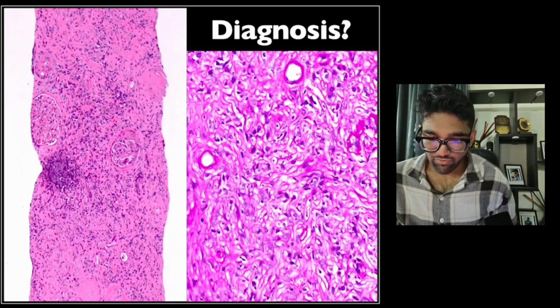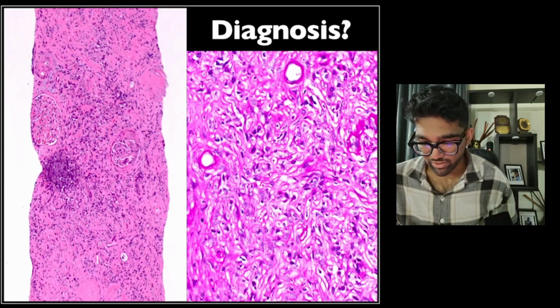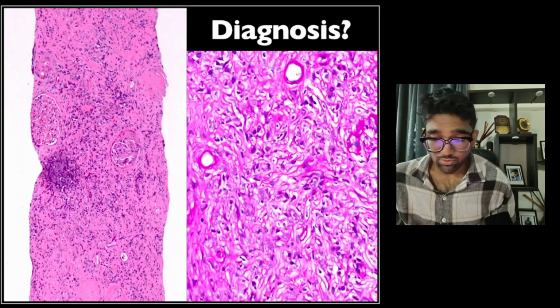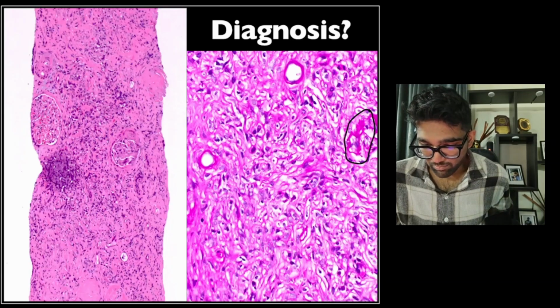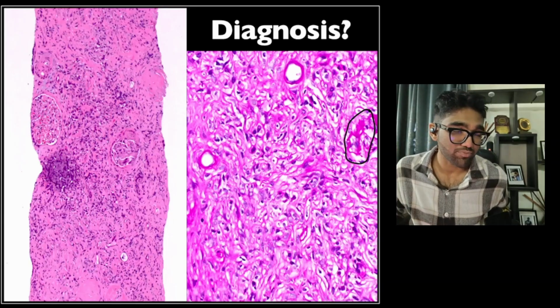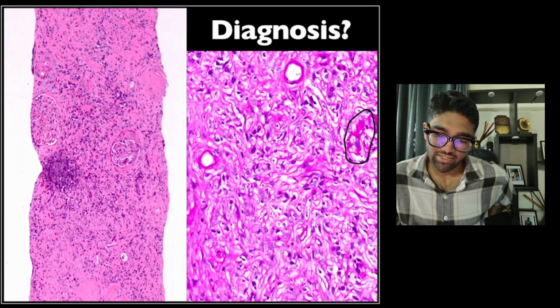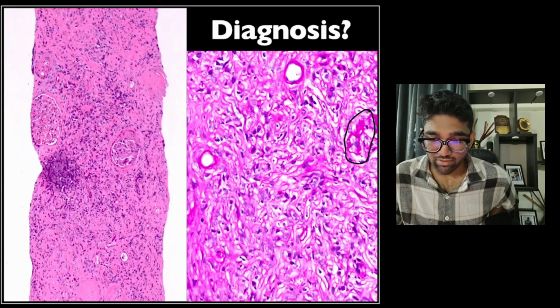There are myofibroblasts within the collagen, and you see some lymphoplasmacytic infiltrate, so lymphocytes and plasma cells infiltrating into the interstitium, and on this side there is a little bit of obliterative thrombophlebitis. The name thrombophlebitis should be in quotes, but there is obliteration of the vessel, a slight thrombus formation within the vessel, and some endothelial cell proliferation. So the diagnosis therefore becomes IgG4 related disease.